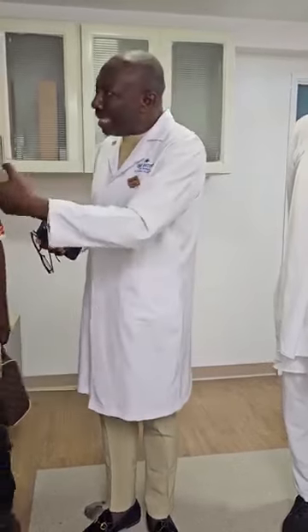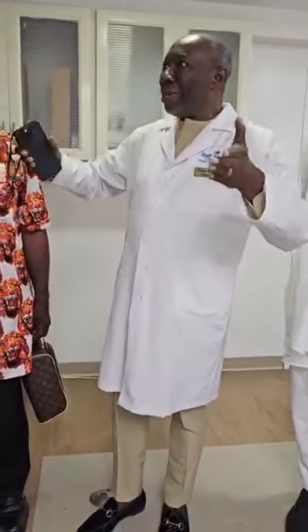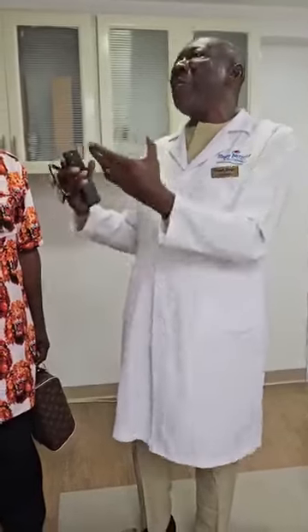So when we inject that stuff, it should go equally in all the areas. Assuming there is a blockage this side, some of it cannot get in here. So when we take the picture, diagnostic, right, the count density here may be 1,000 pixels, and here may be 500 pixels. The 500 is where the blockage is. Exactly.